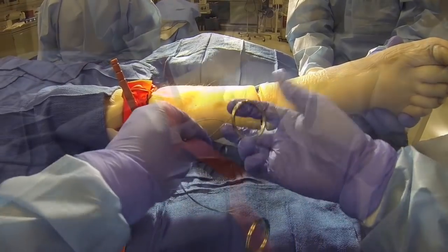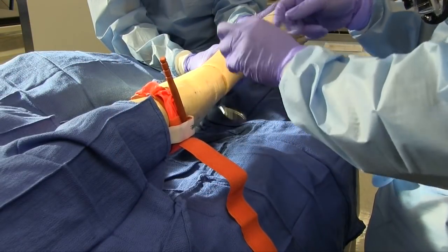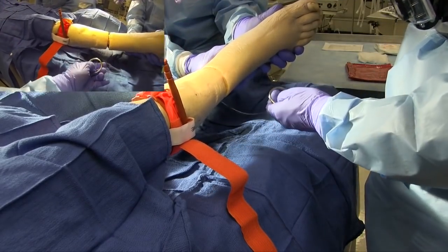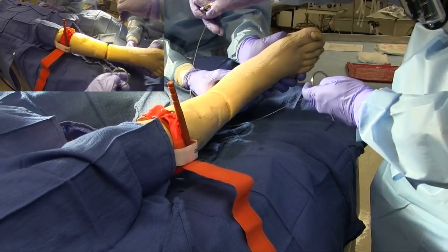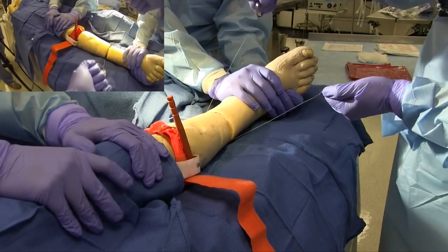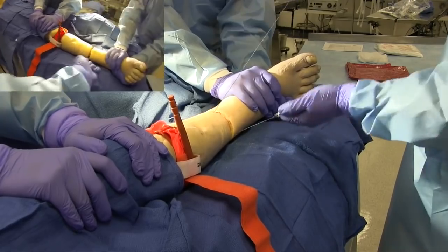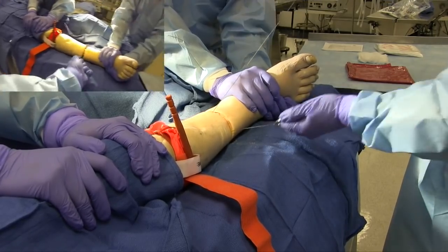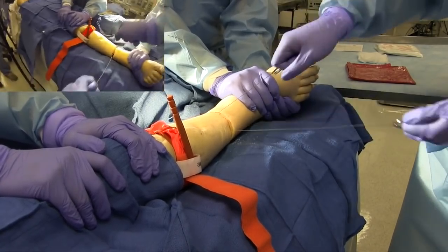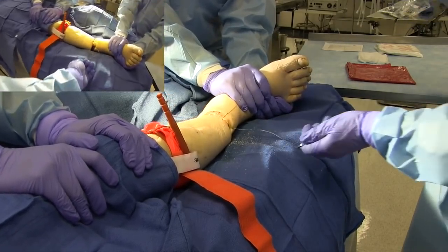Next, take out the Gigli saw and unwind it. Place the Gigli saw around the exposed bone while holding a handle in each hand. Utilizing tension with both hands, perform a slow back and forth motion. You want to keep your hands in a 90 degree or sharper V shape. You may need some assistance stabilizing the limb proximal to the amputation site. Ensure that you cut completely through the bone.